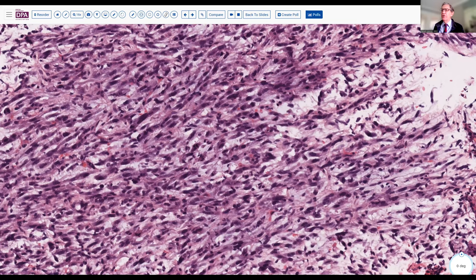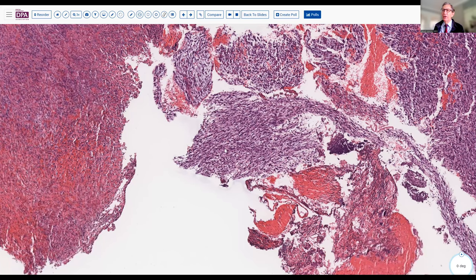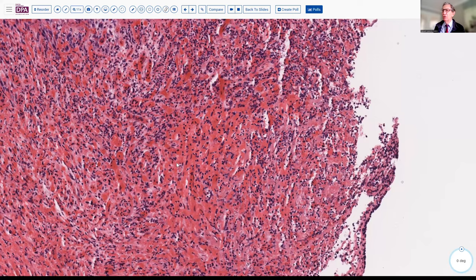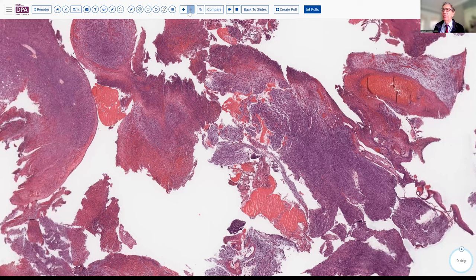In addition to these myxoid areas, we see areas of necrosis and hemorrhage with more dropout of the cells and less viable remaining tissue. So where do we go with this type of differential diagnosis? How would we evaluate this more fully?